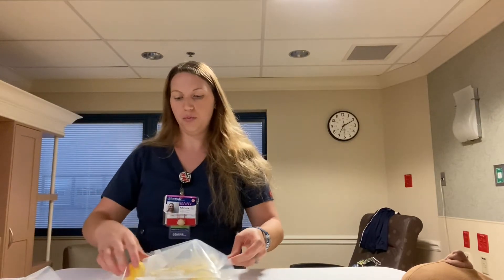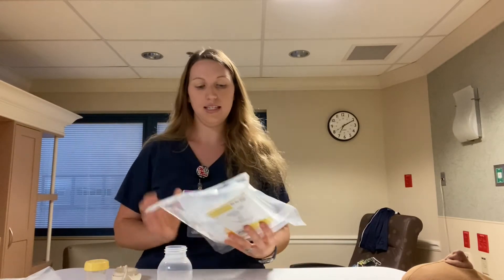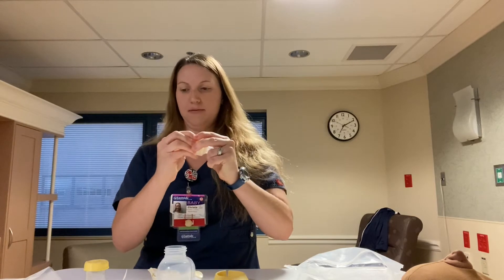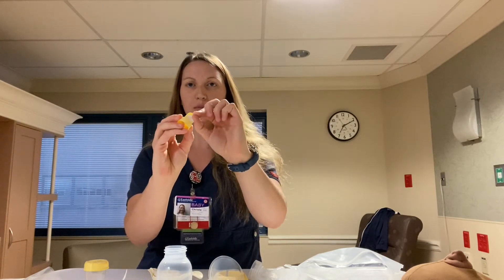When I open it, everything is sterile in here. If I were in a patient room, I would be wearing gloves. There is a book at the front that explains how to set it up. Inside is this little membrane piece, which is what makes the entire pump work.